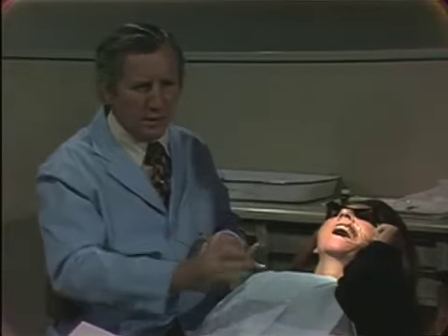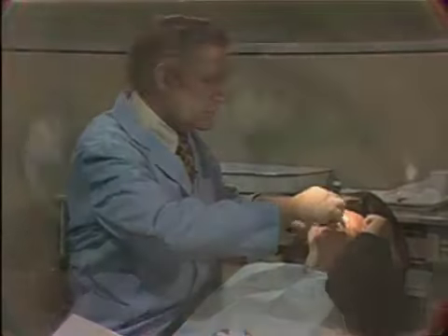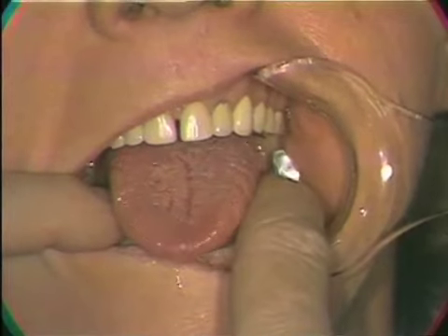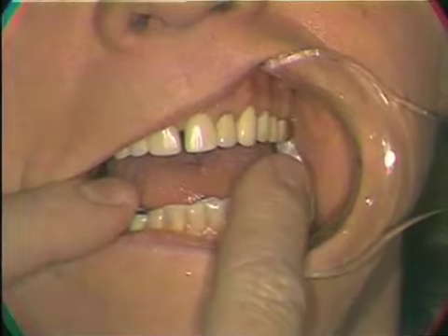You butterfly it to keep the impression material from falling out. When you come over to the patient's mouth, you slip the loaded tray in the mouth. You hold it in position. The patient sticks the tongue way out, and then the patient starts bringing the tongue back to its rest position. Now, don't let the patient take the tongue back too far.